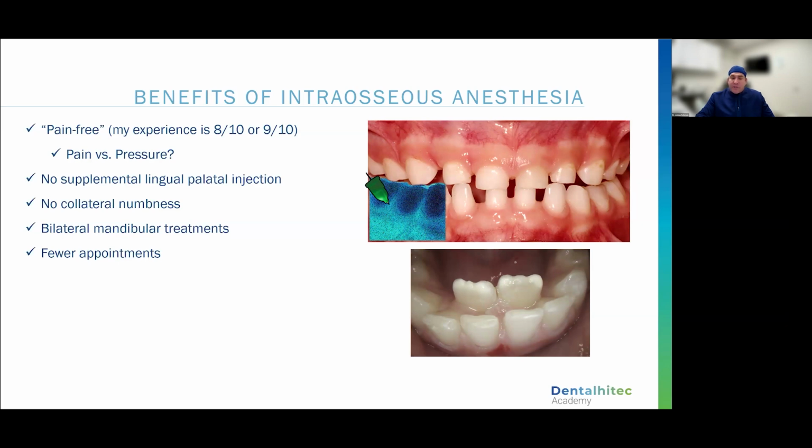And my cooperation level, not only are my patients not having pain with their injections, but they're not having to come back. We all know that first visit may be a little tough for a patient, and that second visit, and by the time you get to that third visit, even cooperative children have a really tough time. And if I can make my appointments shorter and I can have fewer appointments, everybody wins.